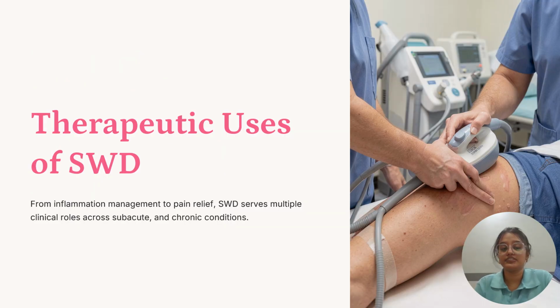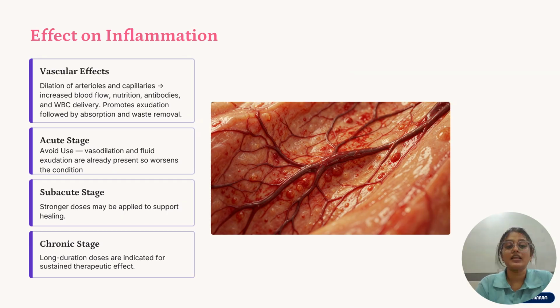Therapeutic uses of SWD. From inflammation to pain relief, SWD serves multiple roles across subacute and chronic conditions. Effect on inflammation, vascular effects: heating causes vasodilatation. Blood flow, nutrition and metabolic effects are increased, and antibody and WBC delivery is also increased. It promotes exudation, followed by absorption and waste removal. So swelling is also reduced as the exudate is removed.